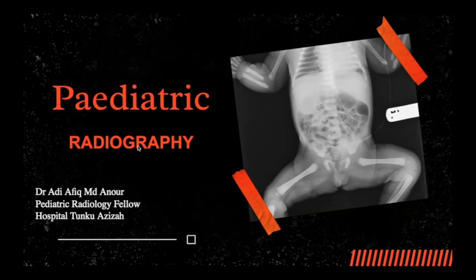Right, pediatric radiography is quite a vast topic. I need to cover pediatric radiographs from head to toe, and it's quite a lot and a bit difficult to cover within 1 hour. But I'm just going to highlight or touch on the important things, particularly those that make a significant difference in the setting of the emergency department. All right.